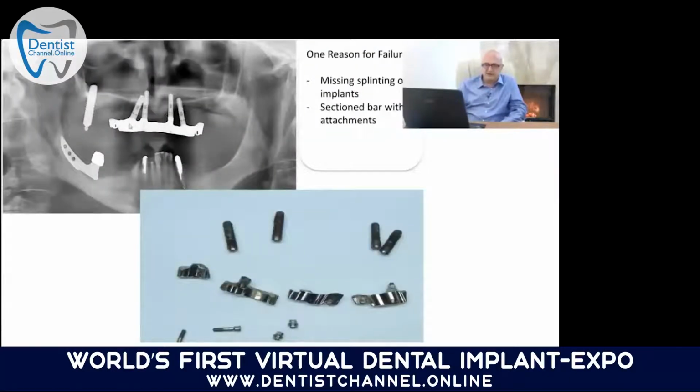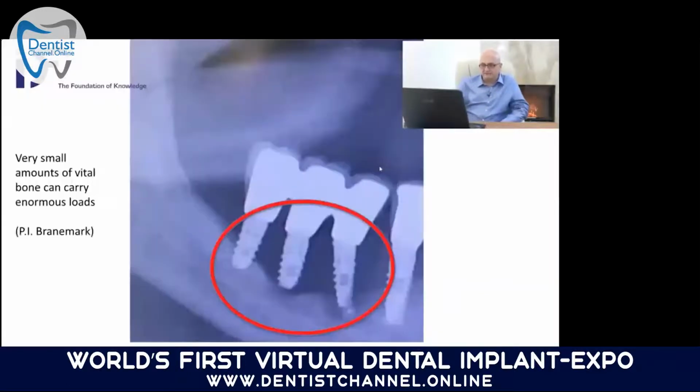This is a special case, all on 4. I'm not sure if you had this. We take out a lot of these all on 4 cases. This case was very special. That's why I show you this, because the doctor has made not 1 bar, but the bar was made out of 4 pieces. And of course, then there's a lot of instability already in the bar. So this is not going to splint the implant, and that's why this failed.